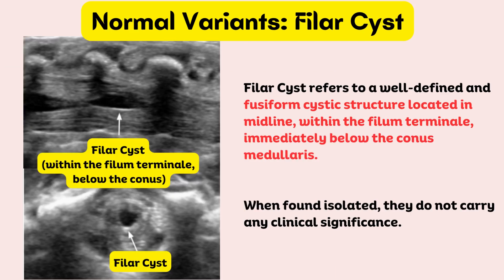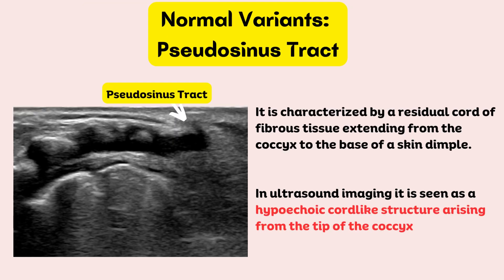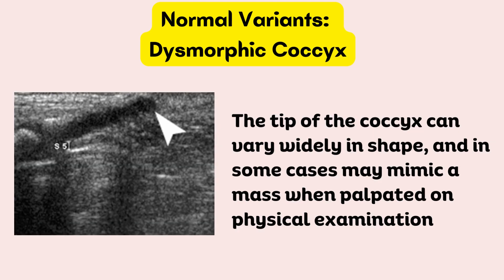Filar cyst refers to a well-defined, fusiform cystic structure located in the midline within the filum terminale, immediately below the conus medullaris; when found in isolation, it does not carry any clinical significance. Pseudosinus tract is characterized by a residual cord of fibrous tissue extending from the coccyx to the base of a skin dimple; on ultrasound imaging it is seen as a hypoechoic cord-like structure arising from the tip of the coccyx. The tip of the coccyx can vary widely in shape and in some cases may mimic a mass when palpated on physical examination.